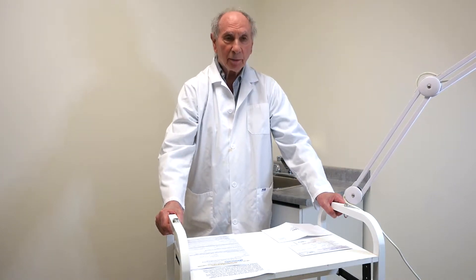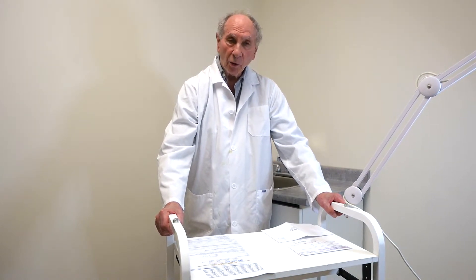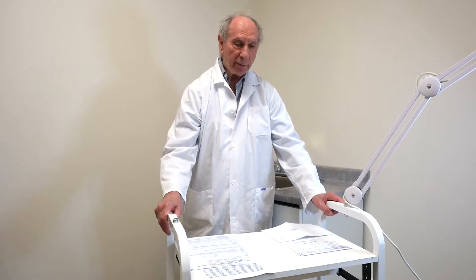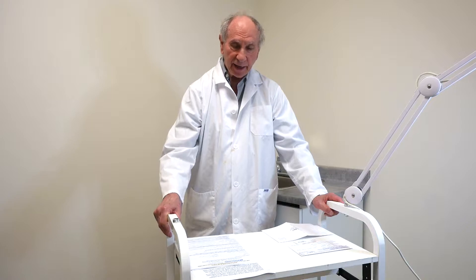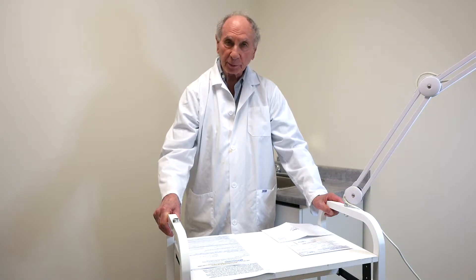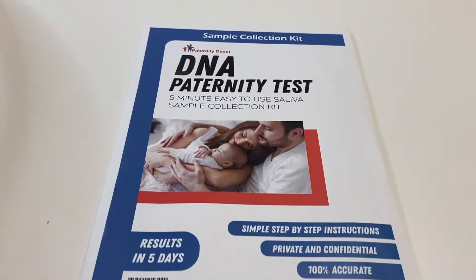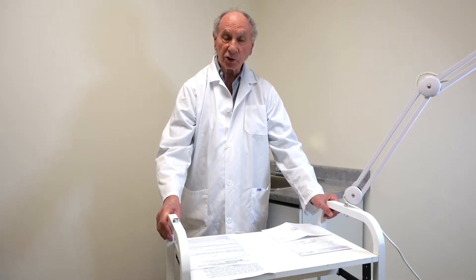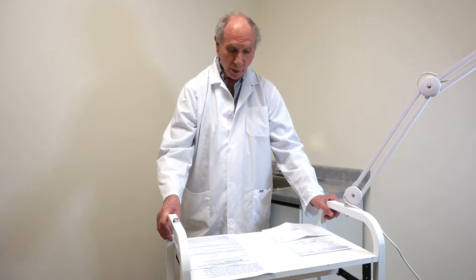My name is Dr. Harvey Tenenbaum and we're going to demonstrate to you the easiest and most precise way to take swab samples for the purposes of paternity tests. This is simple and straightforward. Most people have no problem, but we want to make sure that you get it right when you do it.